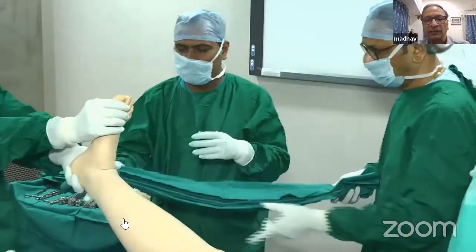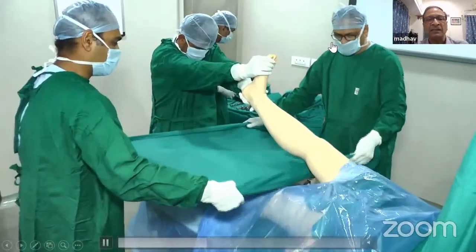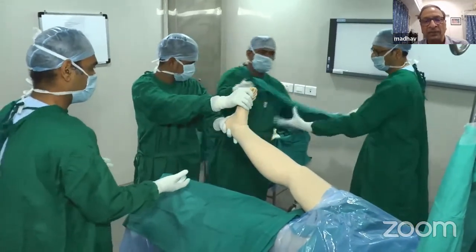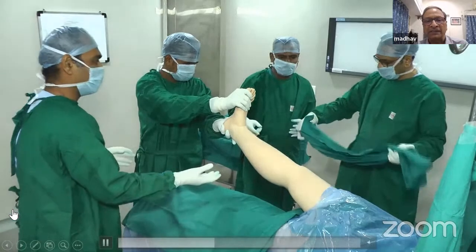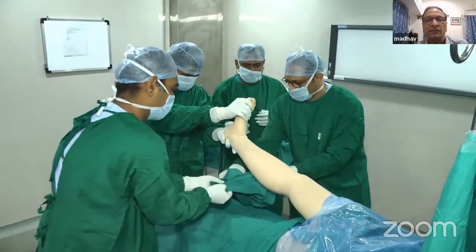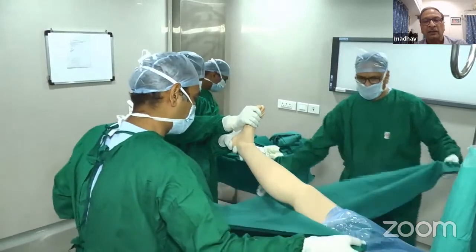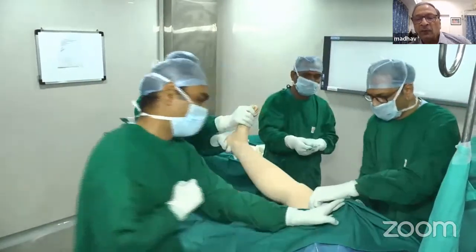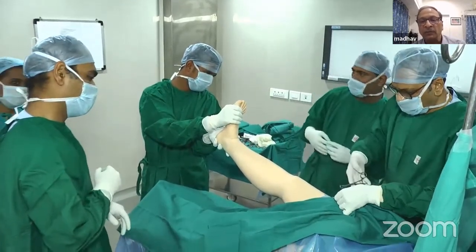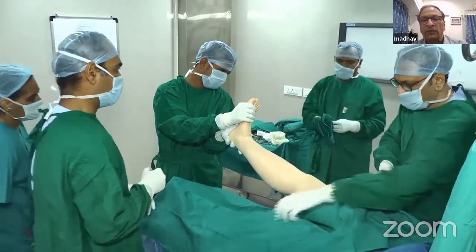After you have isolated the part with 2 sheets, now you take a medium size sheet. The assistant has now moved to the foot end and he is holding the foot. You take a medium size sheet and put it on the plastic sheet below the leg. Next, you take another big sheet and open it from both the sides and take it around the thigh, bring both the ends anteriorly and secure it just below the tourniquet with a towel clip.